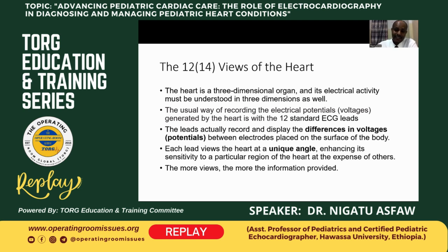ECG lead readings, and in pediatrics we use additional leads, particularly V4R, which will be placed opposite to V4 on the right precordium, and that will give additional information about the right ventricle, which usually has abnormality in young children, particularly less than 5 years, and in young infants, where there is physiologic hypertrophy of the right ventricle.